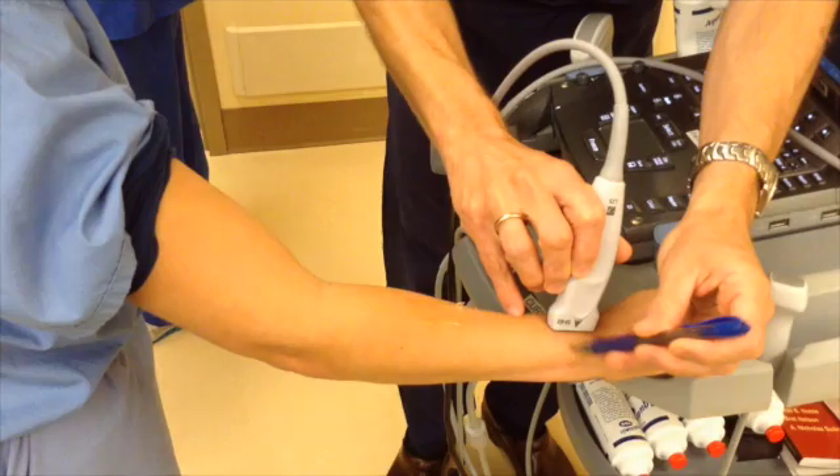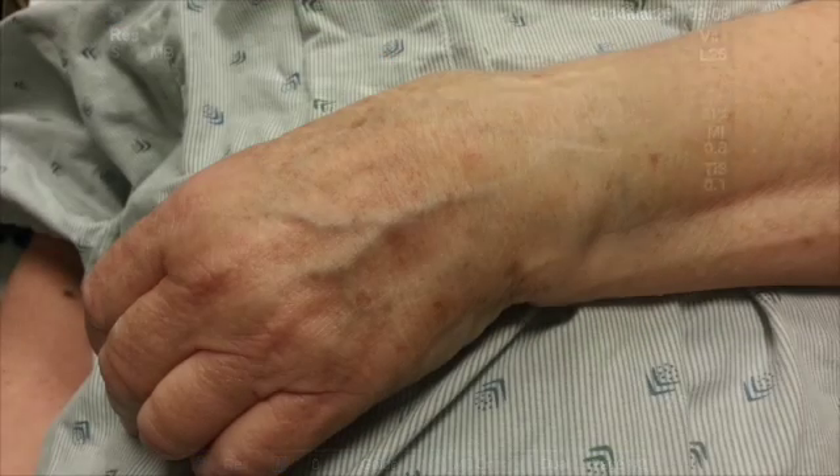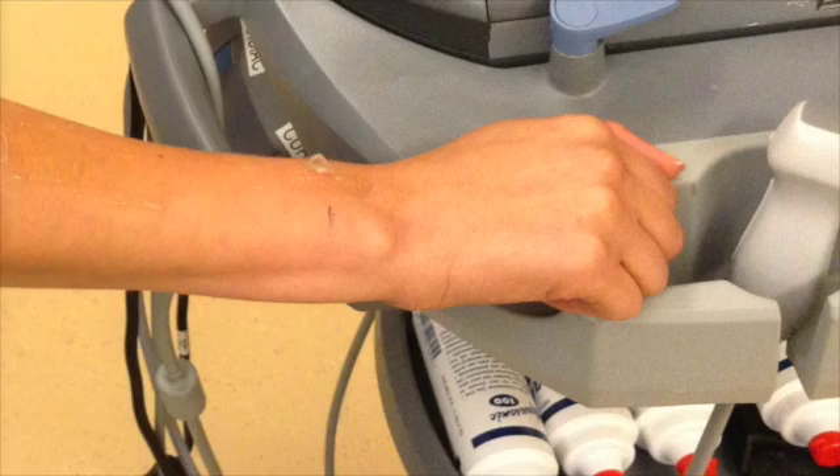Perform the hematoma block in standard fashion with your needle entering obliquely into the fracture site. Perform your reduction in the standard manner and make the patient's wrist look just like new.